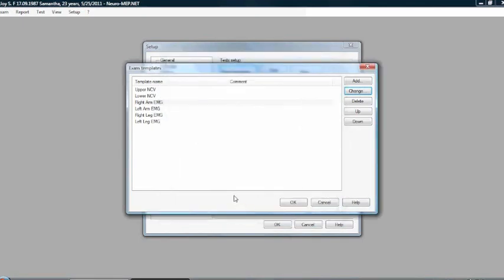Now that we've done this, if you click OK, every time you load these things, when you press test next, test next, test next, it's going to show you these muscles in that order. I'm not going to click OK because I like these setups, so I'm going to click cancel. But if you click OK, it will save it. So in this case, I'm going to click cancel.